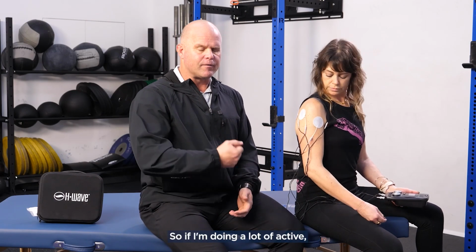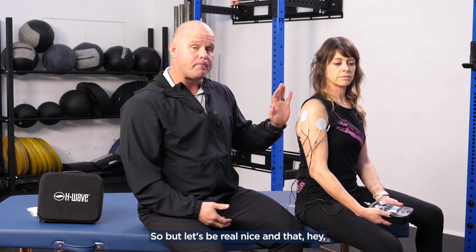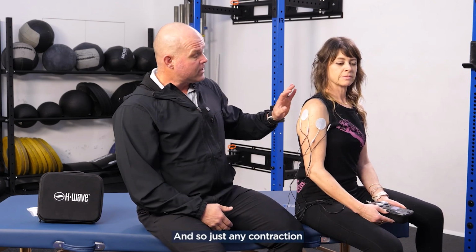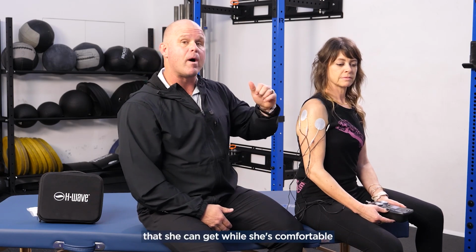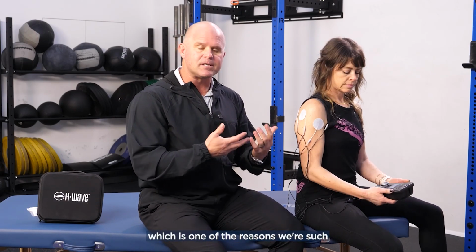Remember, ultimately, I don't want to be fighting myself, so if I'm doing a lot of active movements in this, it's going to override some of the signaling we're getting from the device. But let's be realists, we may not be able to be completely passive and resting in this situation. So any contraction that she can get while she's comfortable, laying on the couch, even working, this can be a really powerful way to do a little bit of decongestion, which is one of the reasons we're such fans of this.